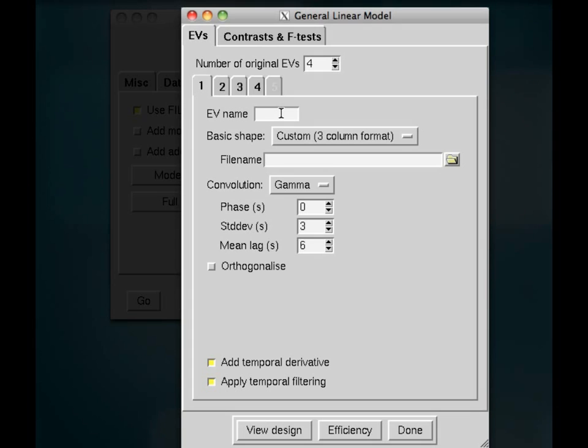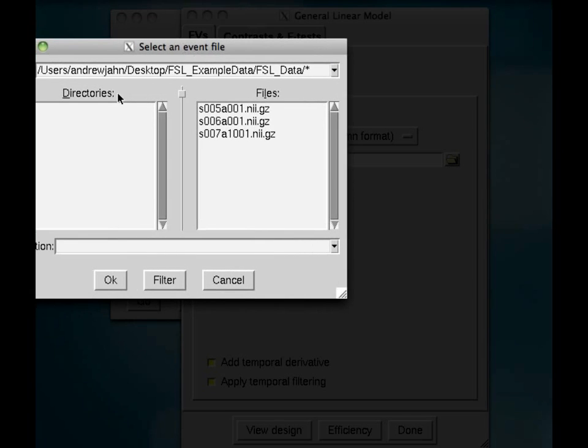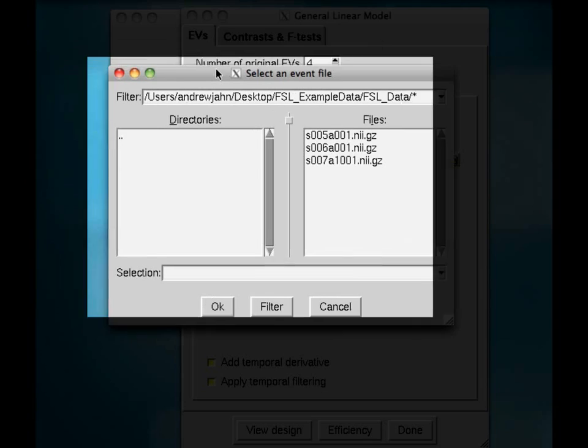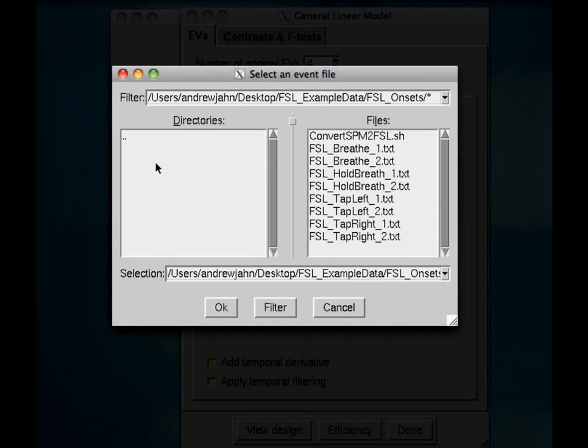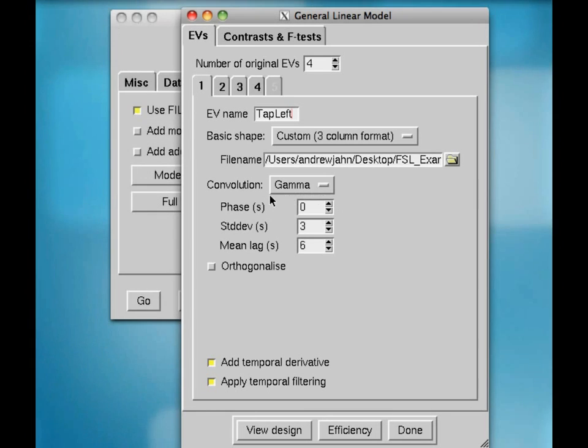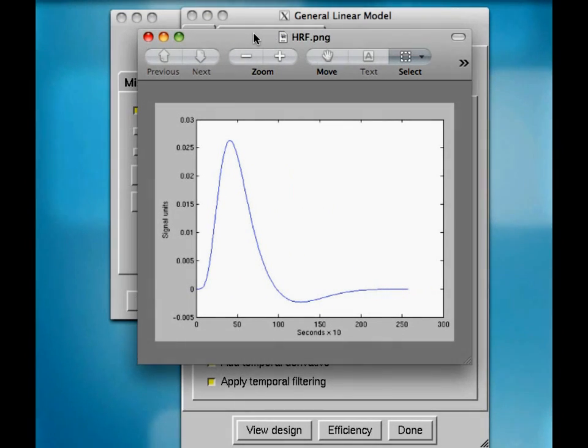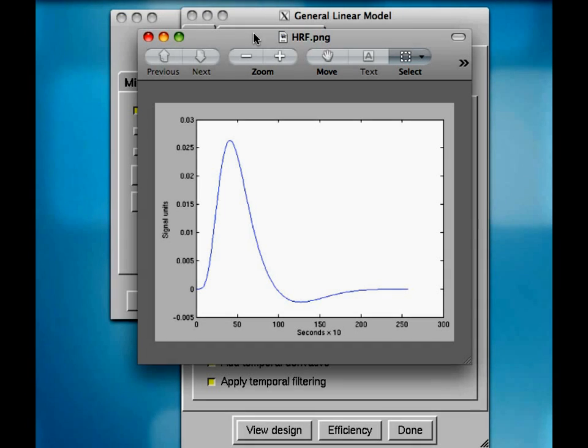So, I'm going to go ahead here, and this first EV is going to be called tap left. And for the file name, go into FSL underscore onsets and FSL underscore tap left underscore one. And we're going to be convolving it with a gamma. So, in other words, this is what a gamma function looks like.